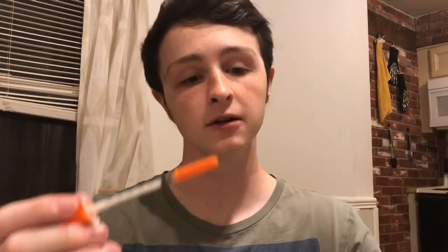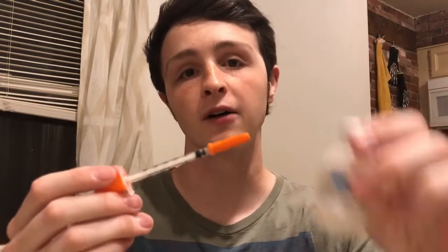It seems that many people don't know how to use them, so I'd like to make a video about how to fill your syringes with insulin, either from a pen or from a vial. Alright, let's get started. First, we'll do the classic — the vial.